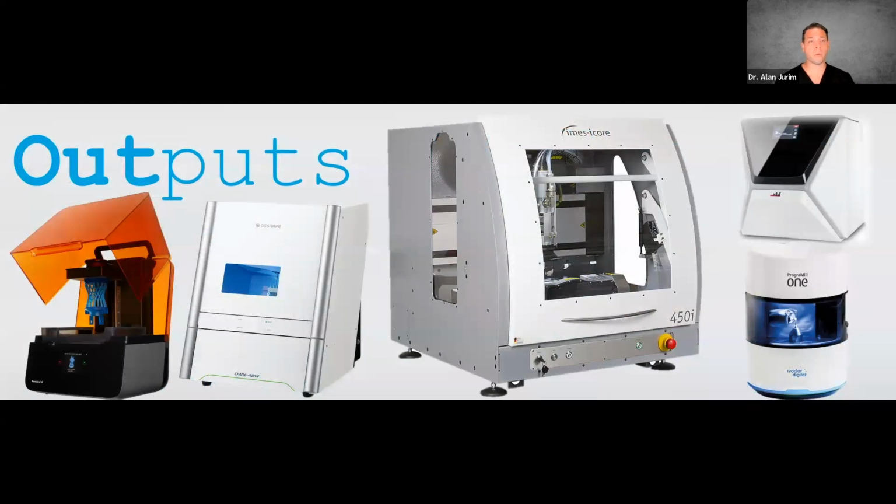Milling machines are machines which start with a solid block of material, and it's a reductive process. It will keep on cutting away until you end up with what you want. And 3D printing is an additive process. It will build your part incrementally, layer by layer, as it prints. Now, the important part to keep in mind when we talk about these two outputs is that 3D printing is going to be overtaking milling relatively soon and very fast, almost exponential in speed.